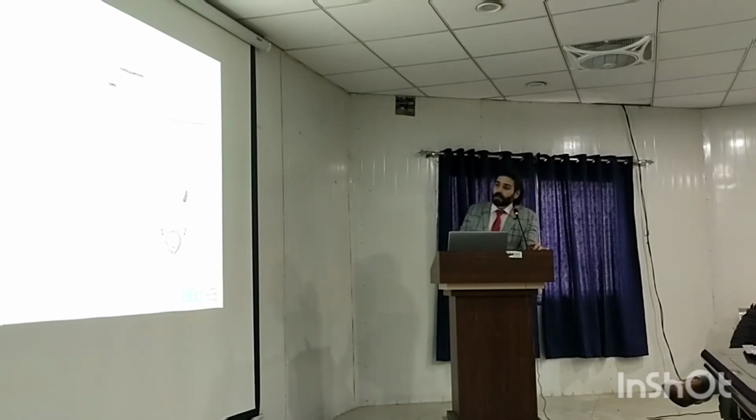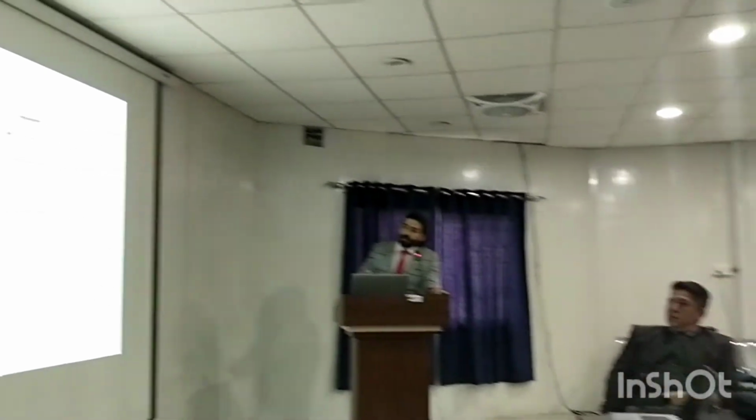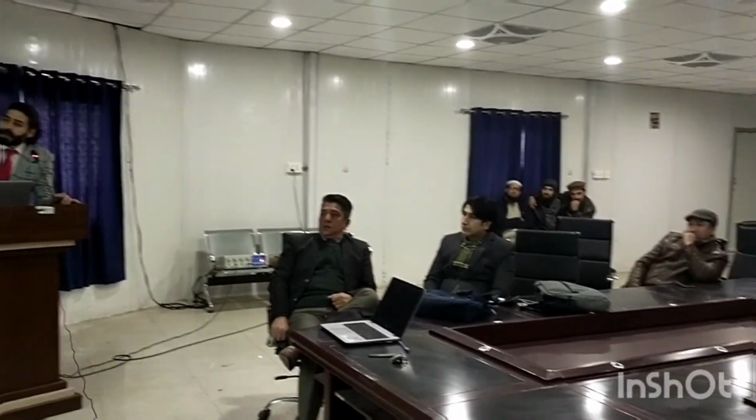So this one basically is the sheath. This whole instrument is the nephroscope, and this is the light source, and here is the irrigation. You can see the whole system is introduced through a single port, like a single approach.